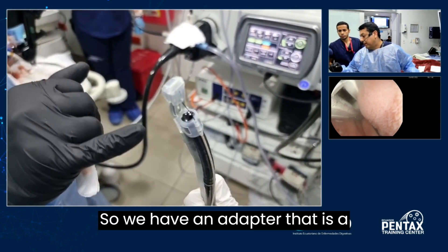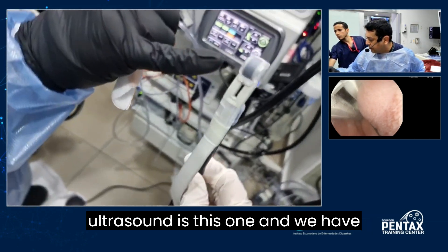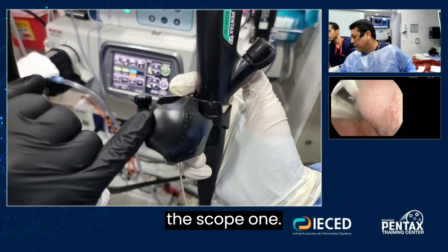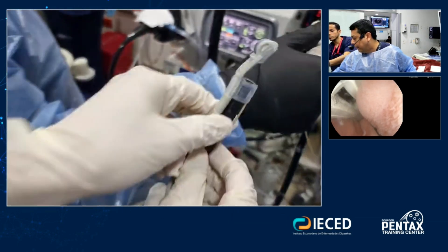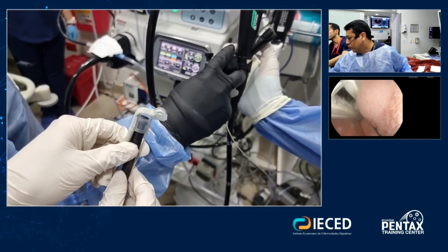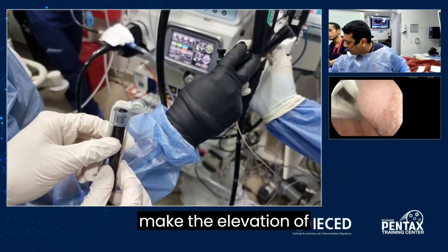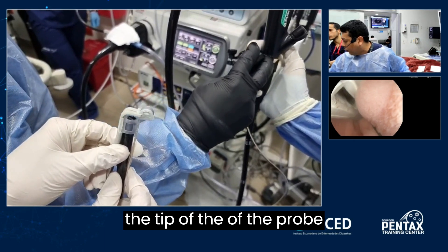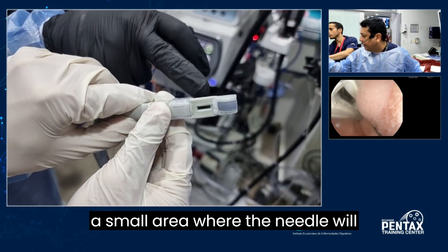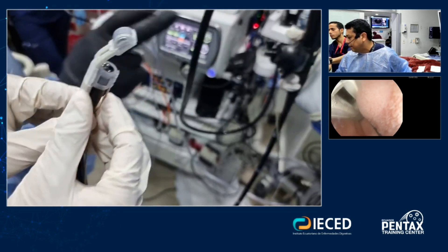We have an adapter that is a plastic adapter, and the ultrasound tip is this one. Here in the handle of the scope, we have an adapter that permits to make the elevation of the tip of the probe, and there is a small area where the needle will go. So we have a linear scope over a standard gastroscope.